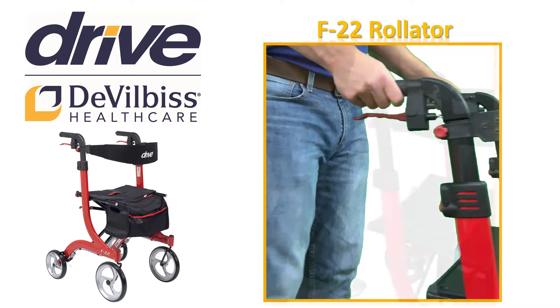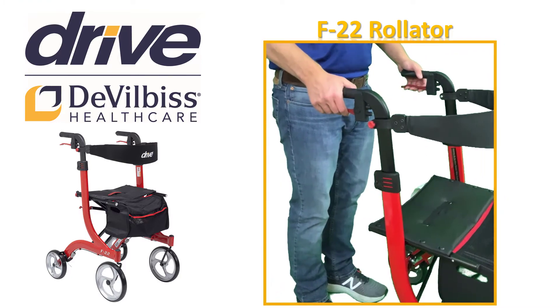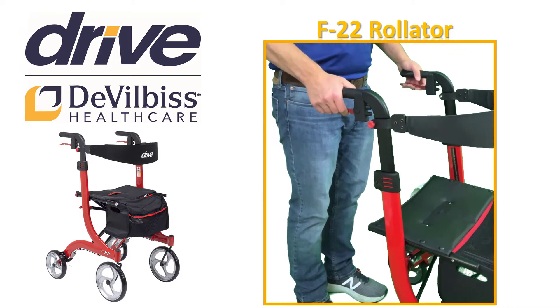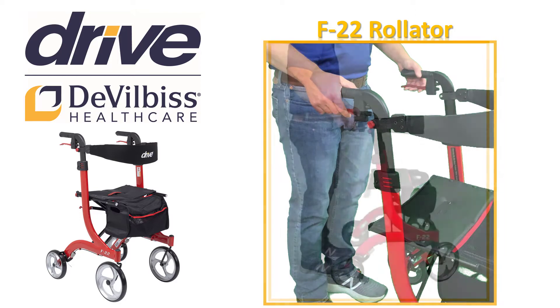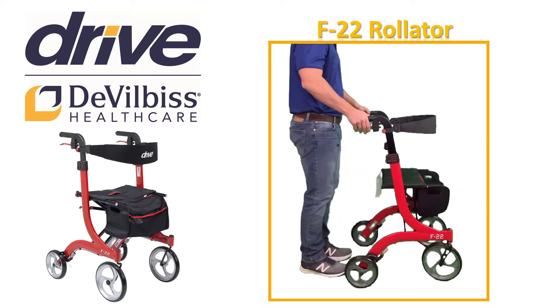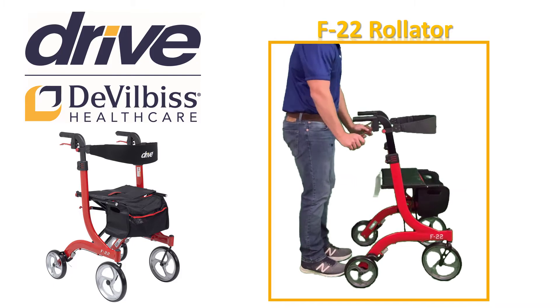Before we make our adjustments to the backrest support, let's review the brakes. When you are walking and you want to slow or stop, simply pull up on the red handles by squeezing your hand until you stop. Always brake slowly and steadily. When you release your squeeze, you will be ready to move again. When you are going to park your Rollator or sit on your F22, you need to put the parking brake on.